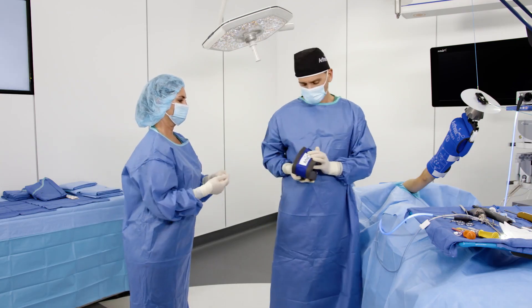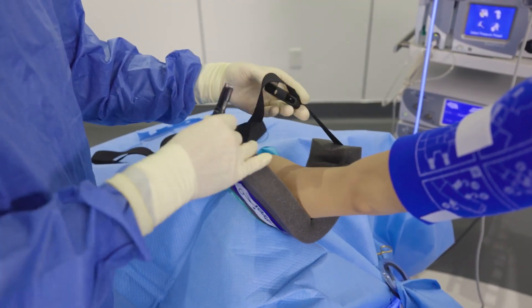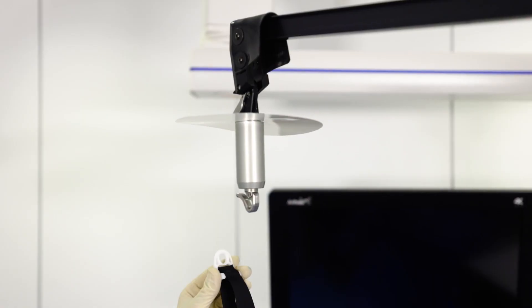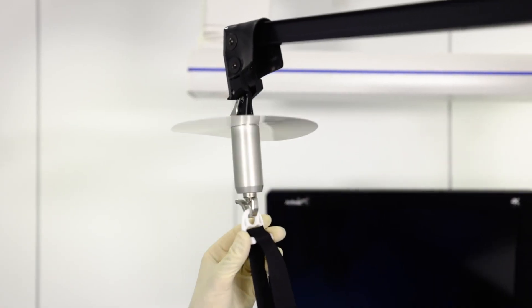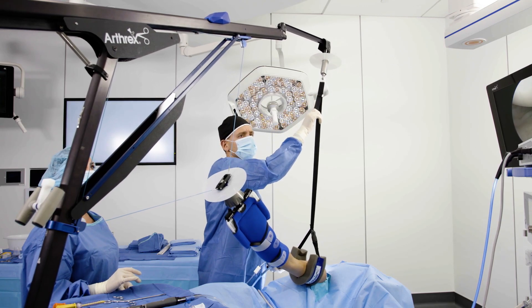Apply the sterile lateral distraction sling to the patient's upper arm and secure it with the buckle. Connect the sling to the grey hook portion of the lateral distraction sling connector and pull the strap down, creating an effective joint distraction force.